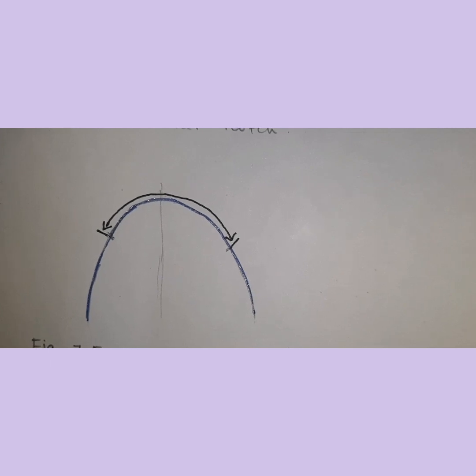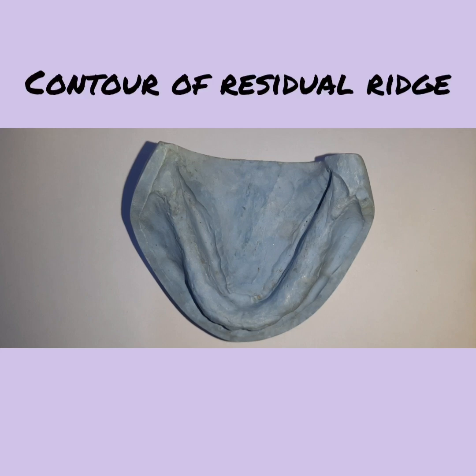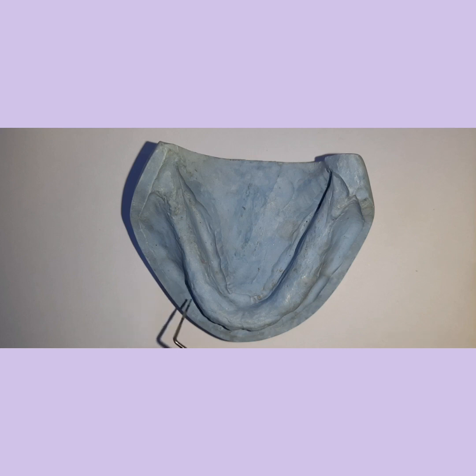That will look odd. Next method to determine the size of anterior teeth is following the contour of the residual ridge. Artificial teeth, whenever we want to place them, should be placed along the contour of the residual ridge that had existed before the patient lost natural teeth.